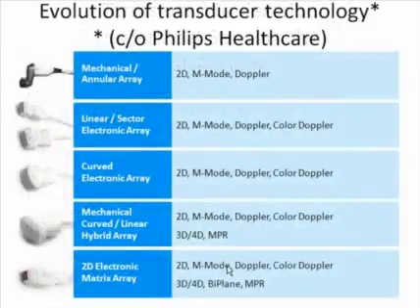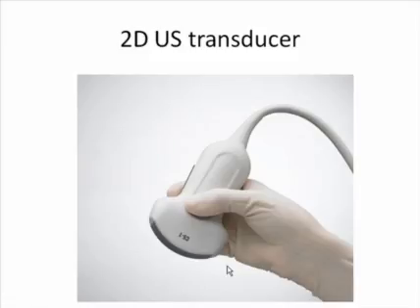Now in ultrasound, we've evolved from the original real-time, which is a mechanical sector rotating group of transducers, to linear arrays, to curved linear, to mechanical curved with a mechanical movement of that transducer array, and now to 2D electronic matrix array. I think the best way of starting in evaluating the pelvic floor is using this type of curved linear array and using it in the 2D mode.